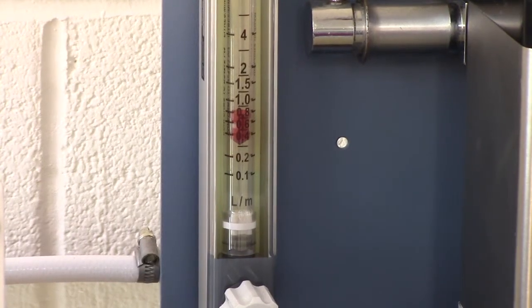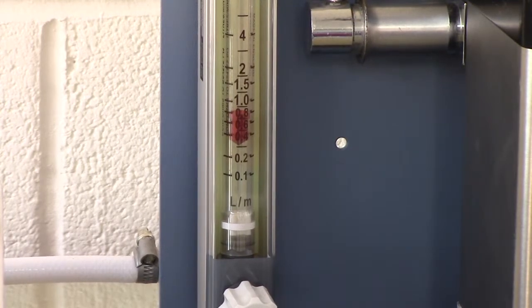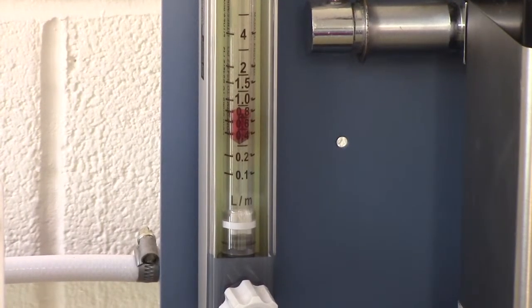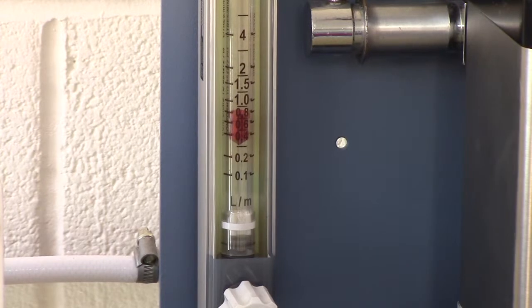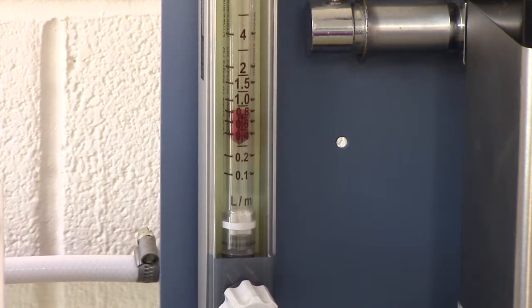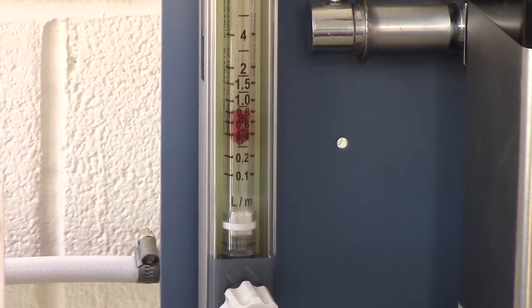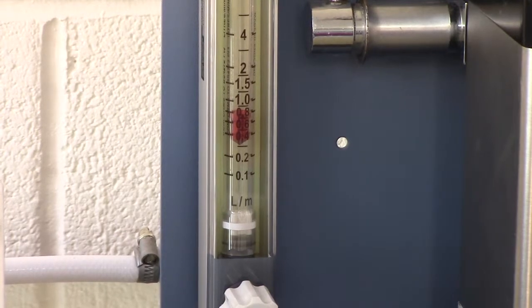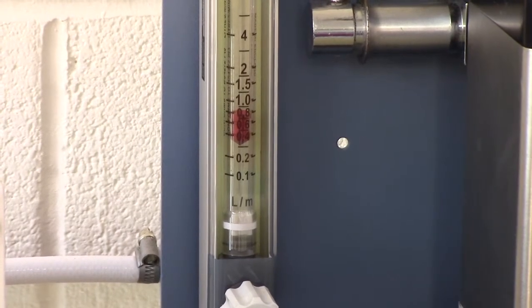In a circle configuration, the fresh gas flow only needs to meet the metabolic requirements of the animal. In practice, it tends to be set generally a bit higher than this, and in fact the settings should be the same as you normally use for a circle system in a spontaneously breathing animal.